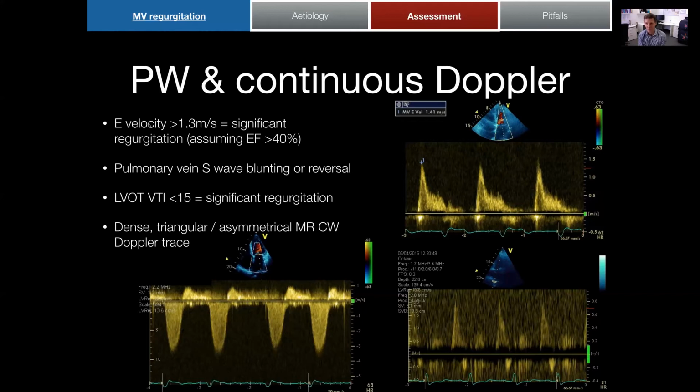And you certainly can get it in the critically ill, and it's really useful if you can, easy with tone. So it's in the pulmonary veins. I really like looking at this because what we've got here is me imaging the pulmonary veins in your apical 4-chamber view. The pearl I've got for that is that you put your color Doppler box over your pulmonary vein. So that's at the back, so you've got to increase up your depth.